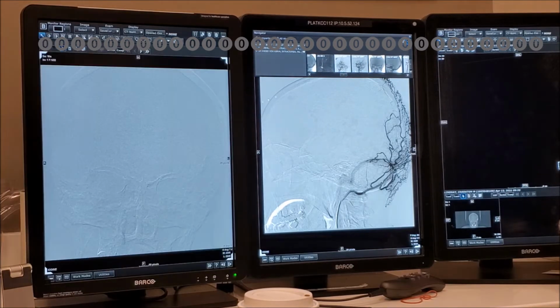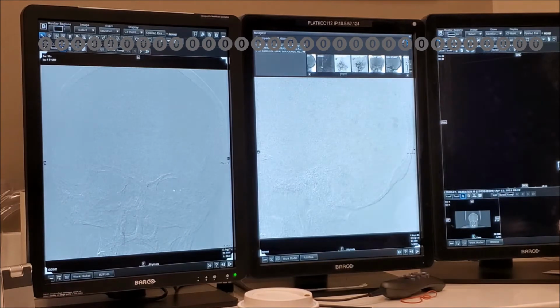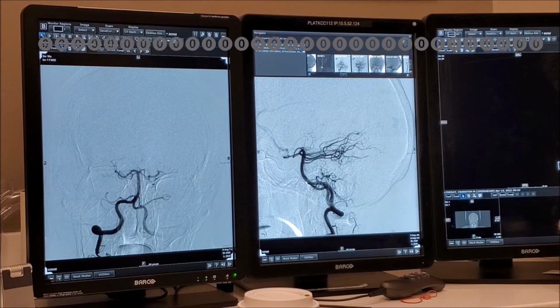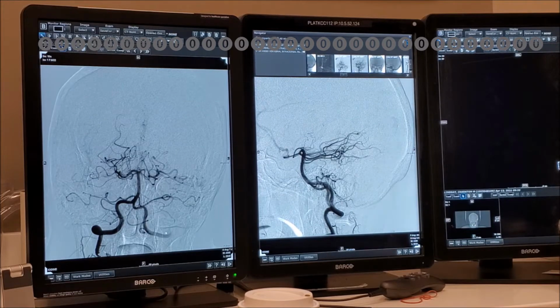Okay, but correct. Now, when you're doing a dural malformation, which vertebral artery is the one you should inject for sure? The ipsilateral. Many times you get an angiogram, everybody's happy because you reflux to the other side, but you should do the ipsilateral. Collateral circulation will always be stronger or more dominant on the ipsilateral side.